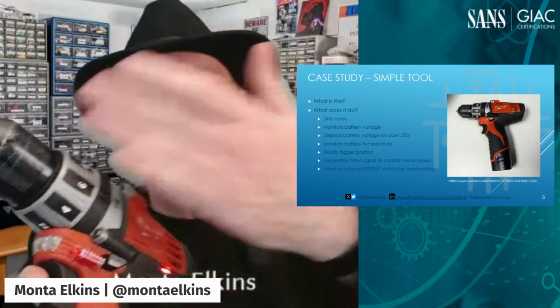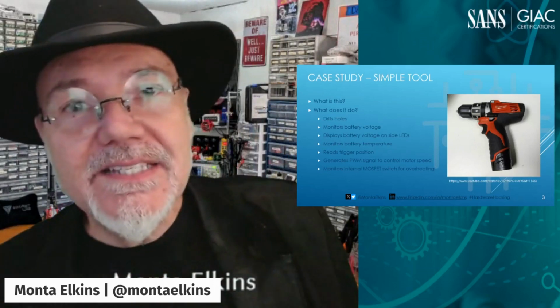But what I want to tell you is that this thing is also a computer. Seriously. There's a computer in here that monitors the battery and the voltage and tells it how quickly to spin. It's a computer that runs software, and computers that run software may be vulnerable.